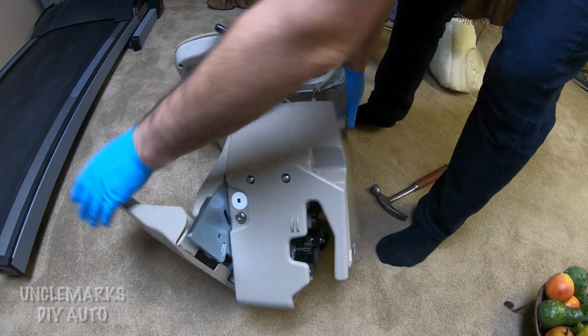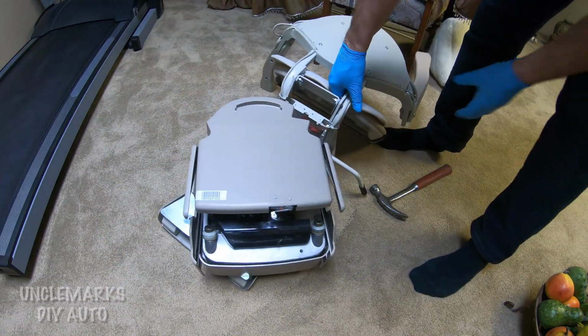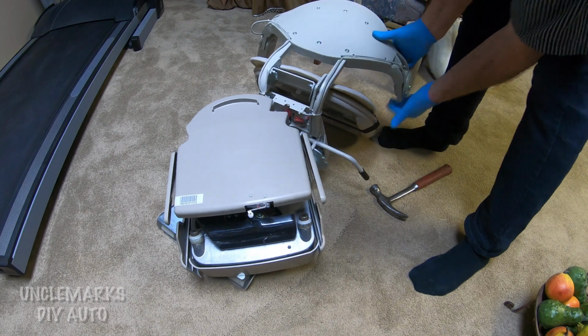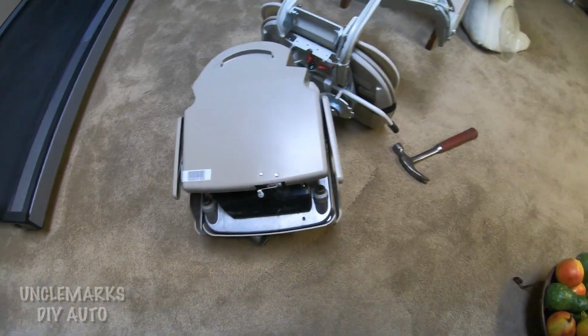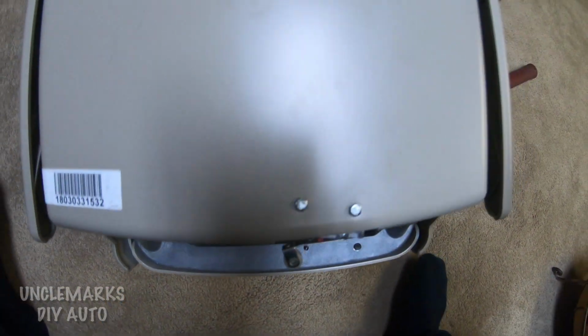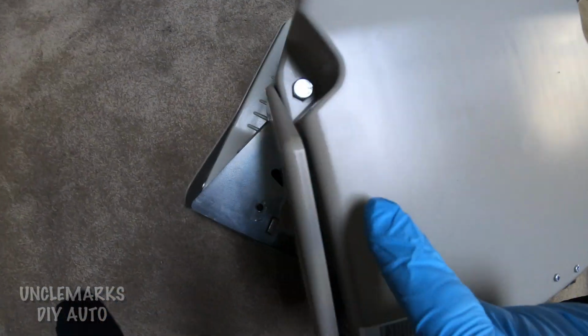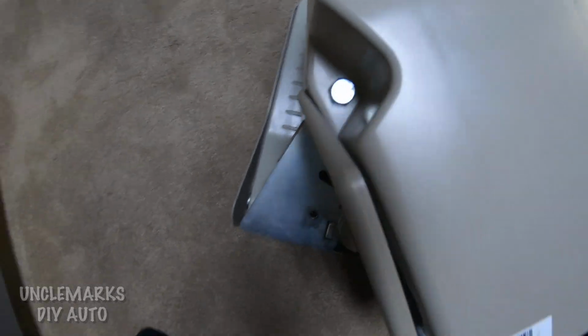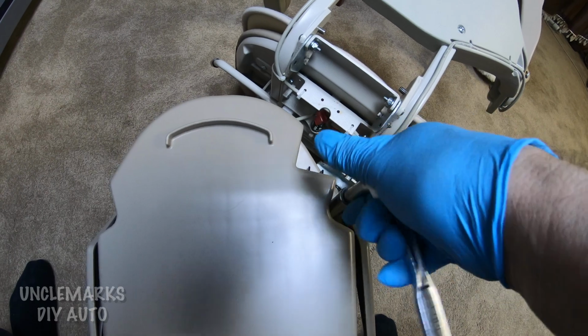I'm going to lift this up now and look at it from the back. I guess we'll try and take this back off. You don't have to have your chair off the rail. It can still be on it. Just have it at the very bottom probably. See, there's a micro switch here as well. Maybe that's bent or something stopped it. There's a bolt on this side, bolt on that side on this type of unit. Yours will probably be similar. If it's not under warranty, you don't have much to lose.